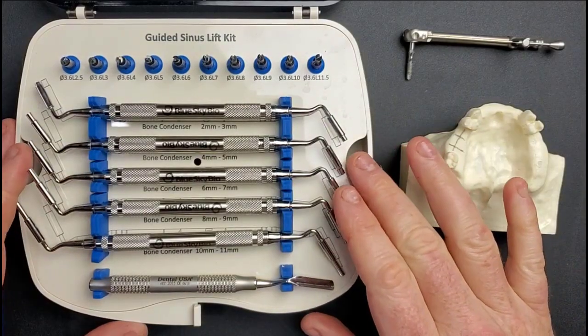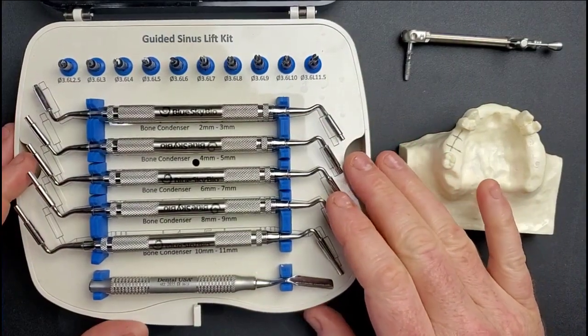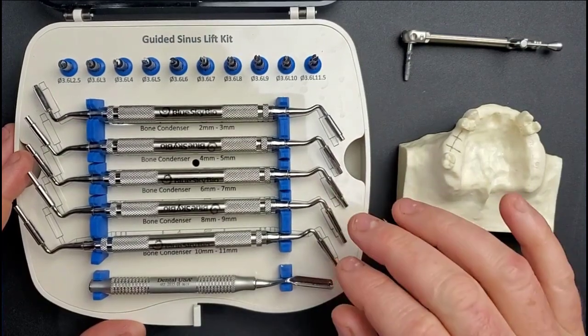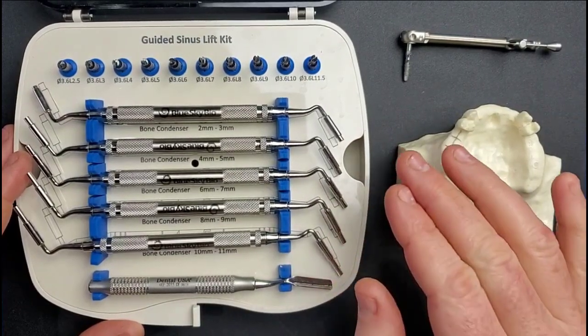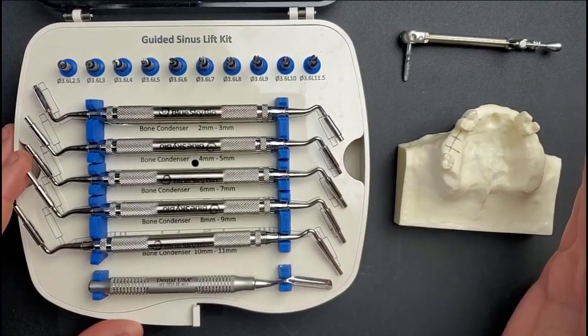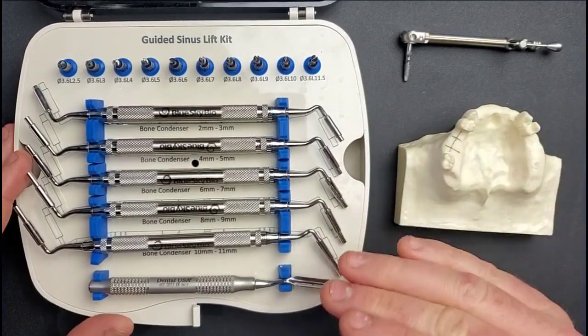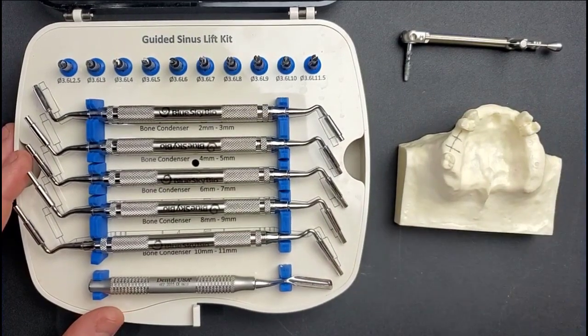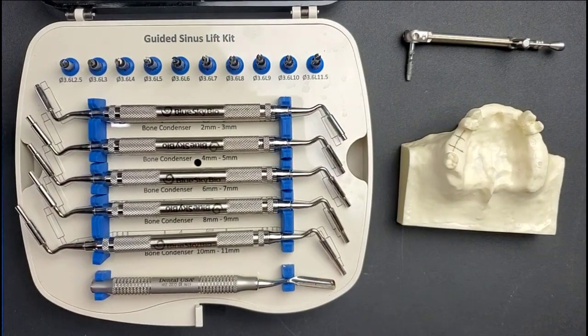Hey, this is Dr. Corey Glenn with BlueSkyBio and I'm going to show in this video how to use our new fully guided Crestal Sinus Lift Kit, but I'm actually going to show how this can be used in a freehand approach. You might just look at this kit and assume it can only be used in a guided approach, however that's not the case. This is really a kit that can serve anybody's needs regardless of how you place your implants.